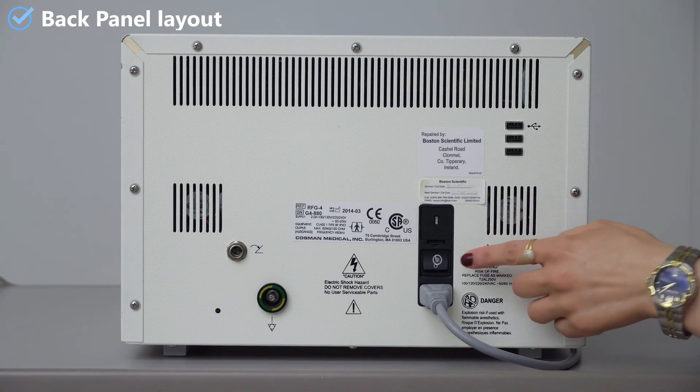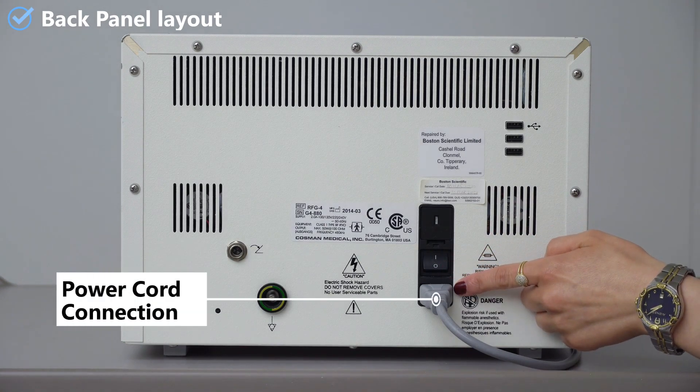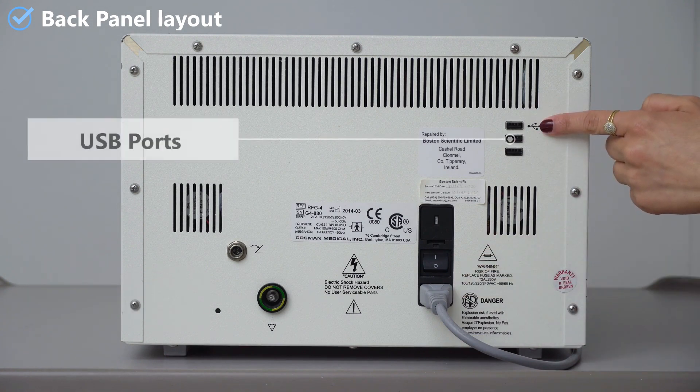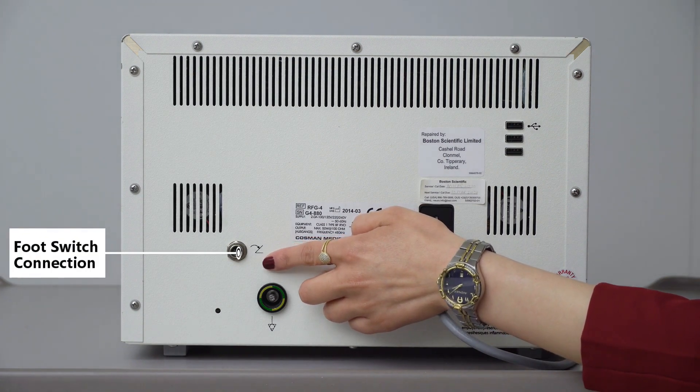Let's start with the back panel layout where we can find the mains power switch, the mains AC power cord connection, USB port, and the foot switch connection which can replace the start-stop button.